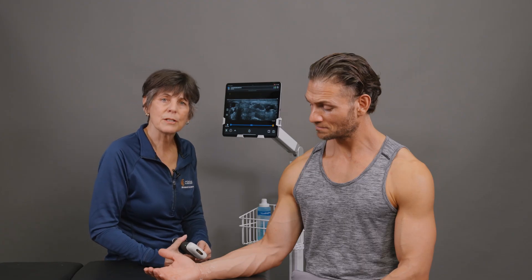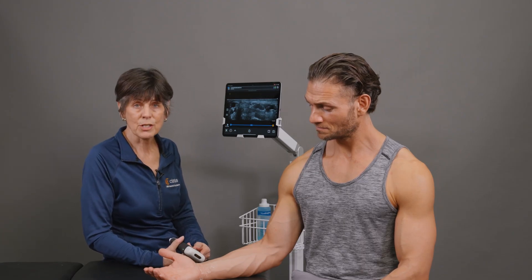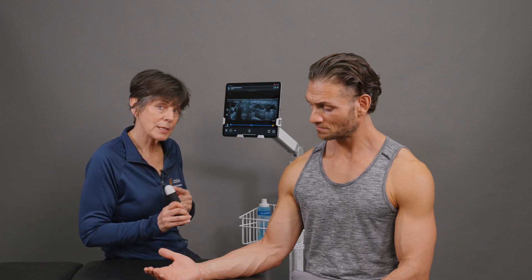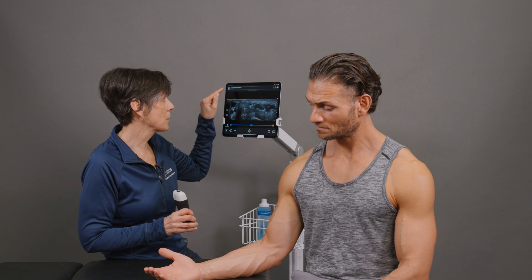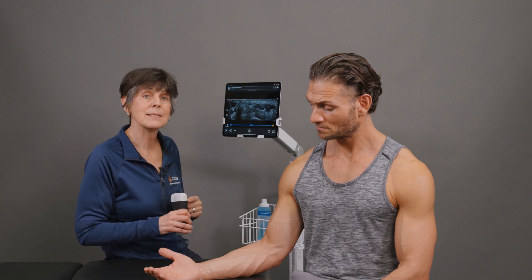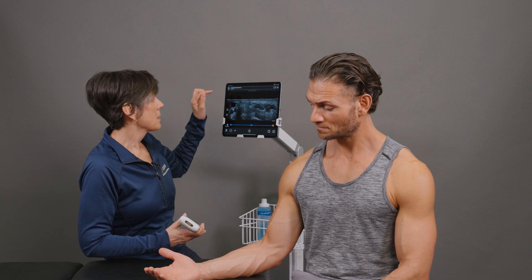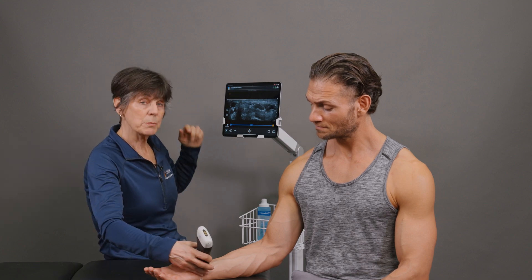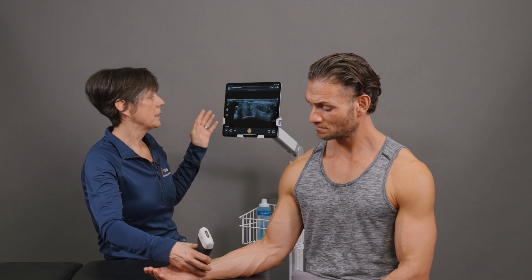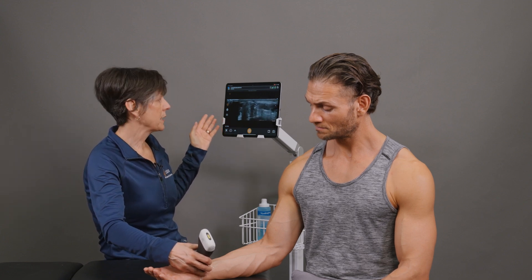To assess the median nerve we need to image it in cross-section and obtain a cross-sectional area measurement. I'm using the L15 scanner in the hand wrist preset. You can also use the L7 linear scanner as well as the L20. So with the hand wrist preset, I'm going to place my scanner right over the carpal tunnel in the area where I suspect the nerve is.